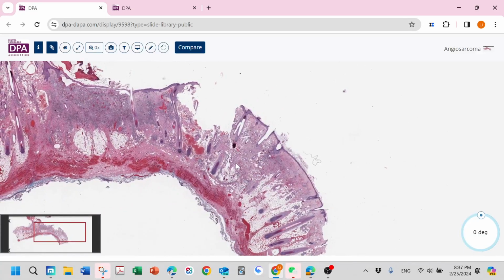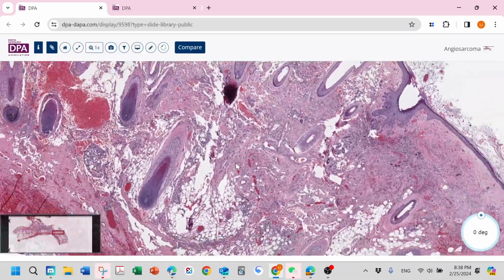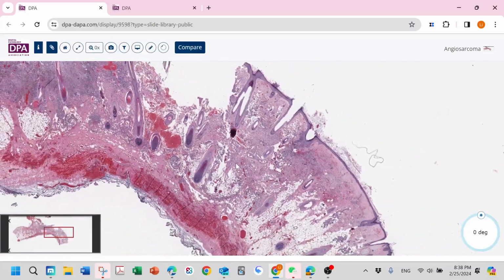If this lesion is related, like happened in the breast after irradiation, maybe in the head and neck tumor, the patient gets irradiation and you get angiosarcoma, you can use CMYC to highlight this post-radiation angiosarcoma, and then maybe you can be sure of the diagnosis. But if not related to irradiation, CMYC will be negative.